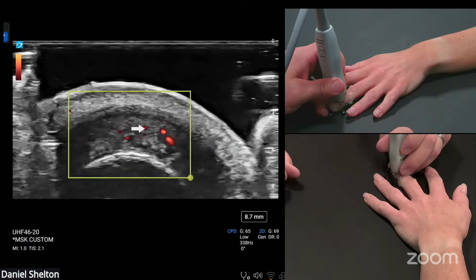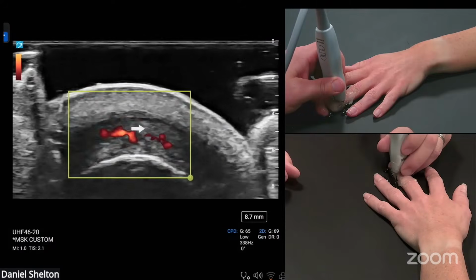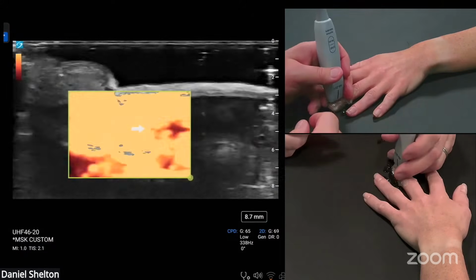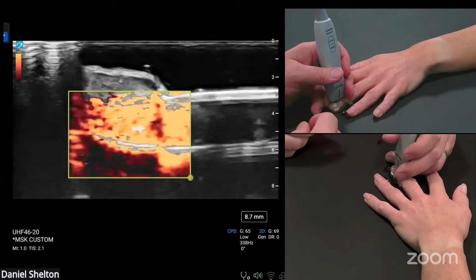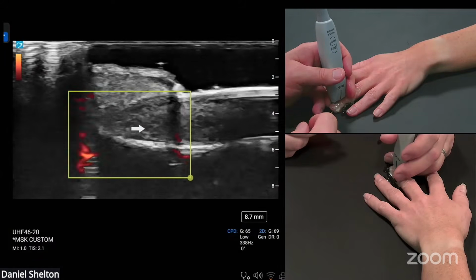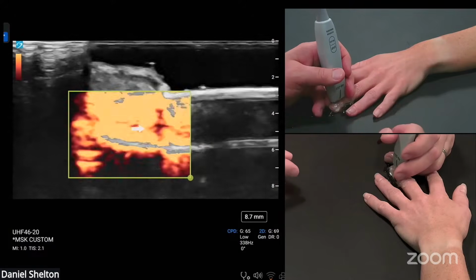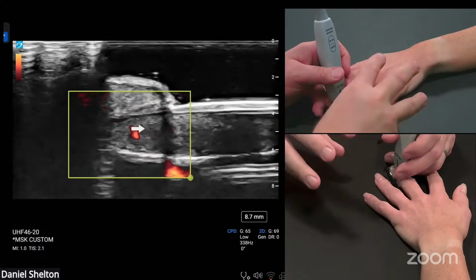So there's that nail matrix just around that root. I'll go long axis to that. What I mean when I talk about color scale: color scale is a lot like shutter speed in photography or cinema photography, where you can have your scale set in properly when you're looking for something that's moving. So imagine a wagon wheel turning in the picture frame like an old classic Western film, and the shutter speed is clicking at its standard rate. Let's just say it's 60 hertz.